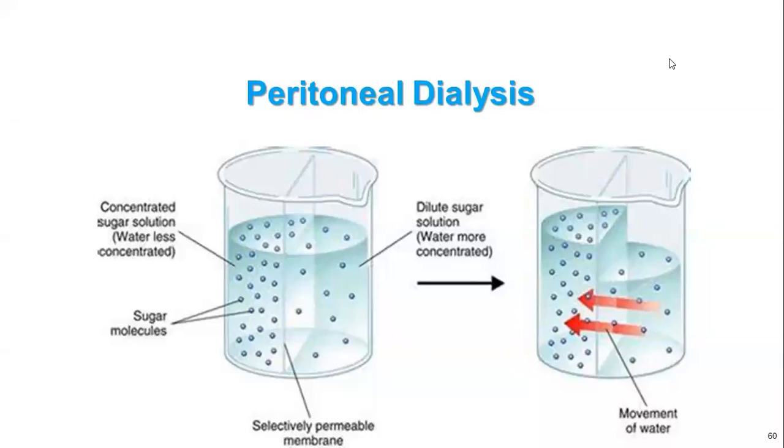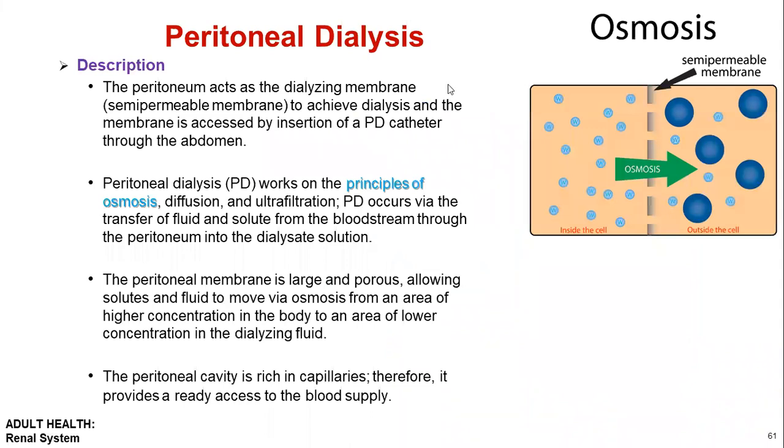So here we go to talk about peritoneal dialysis. Peritoneal dialysis, like hemodialysis, also works through the principle of osmosis, right?